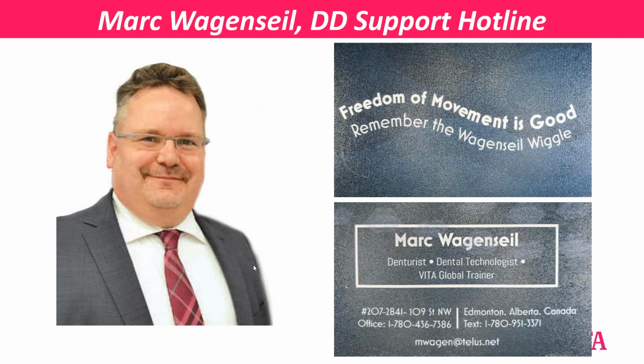So when you're dealing with an implant case, it's the same thing. We want to watch the freedom cusps, buccal upper, lingual lower, and of course, the chew cycle of the patient even more. And the width is just to give you a bowl to hold the food to get crushed. Again, it has to have some girth to it to hold the food to get crushed, so it's more efficient, less chews, less chance of damage. Get rid of that slip and slide. Correct, it works well. Yeah, the hit and slide's been killing us.